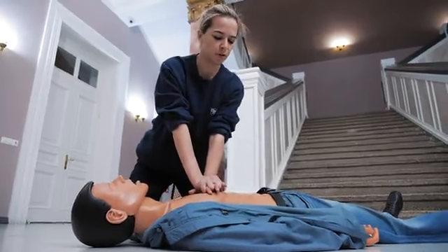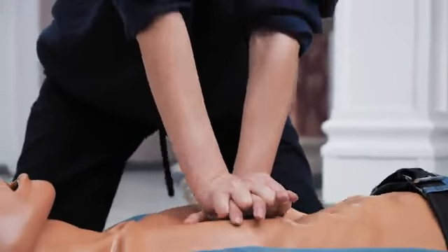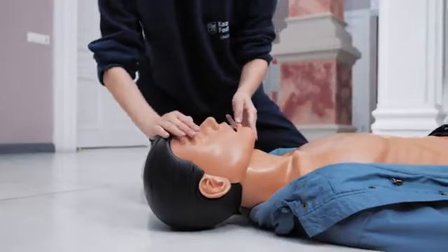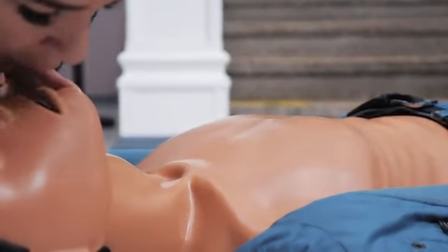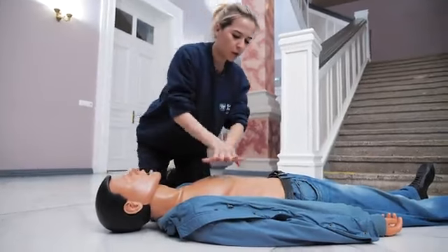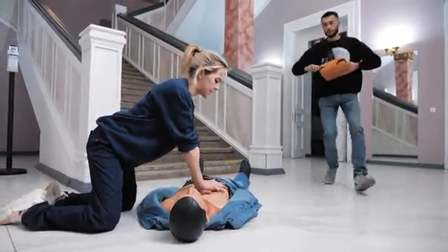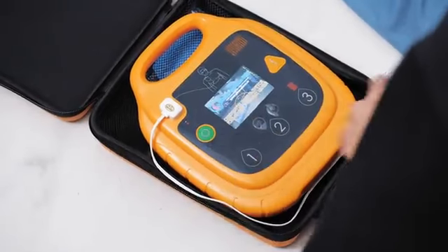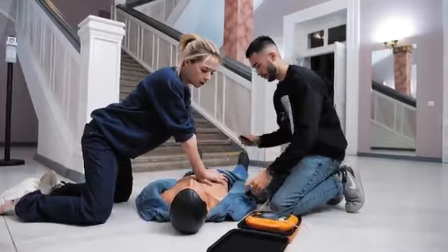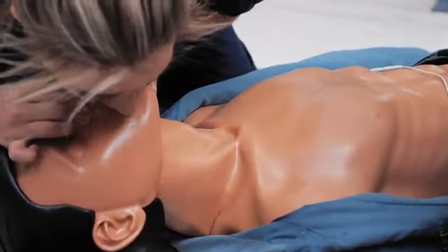Open pads package and apply pads to patient's bare chest.